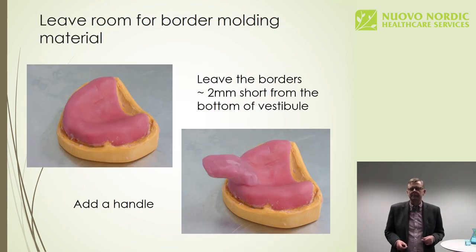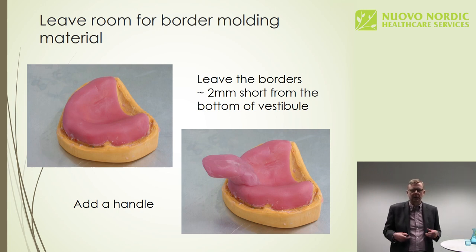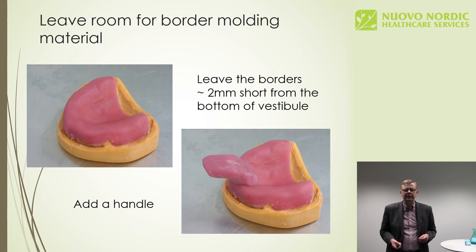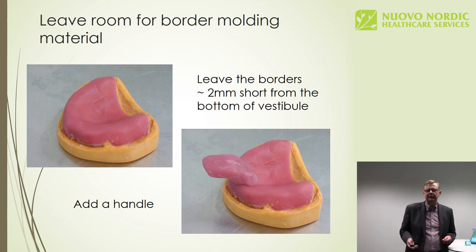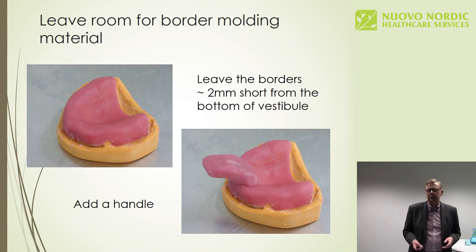The custom tray is made on the preliminary model. You can use any material. We nowadays use light curable materials, but any acrylic tray material can be used. We'll leave the borders of the custom tray short, just about 2 millimeters, in order to have some room for the border molding material.